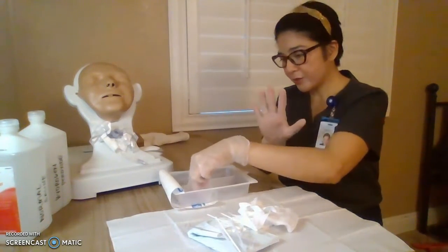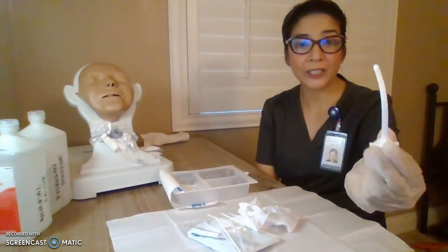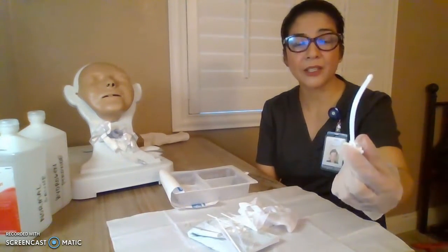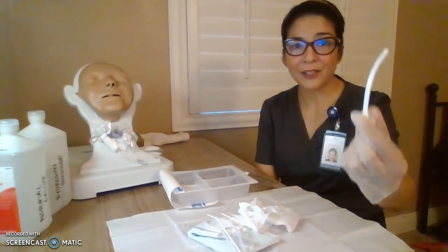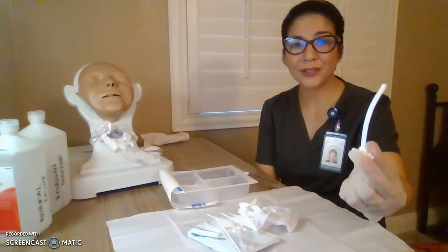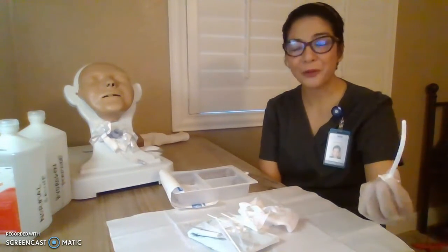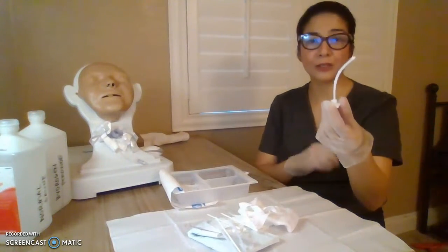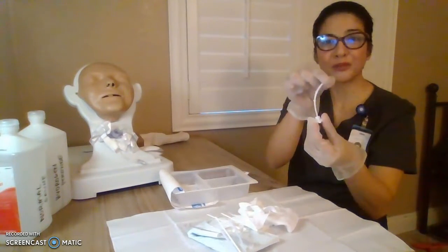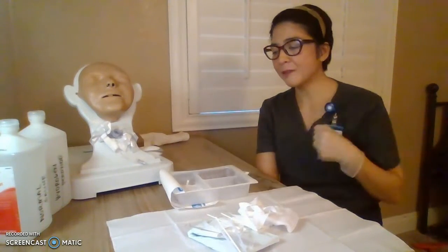Okay, I just want to show you, you're not going to do this, supposedly leave it in there. This is not an inner cannula. This is an obturator. This should be at bedside at all times by your patient in case of any emergency. For the use of this and everything, that's another video. So have it by bedside. The inner cannula will look like a cannula. It will be a tube-like equipment. All right. So have it in there.